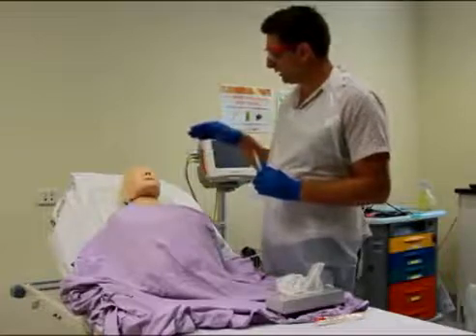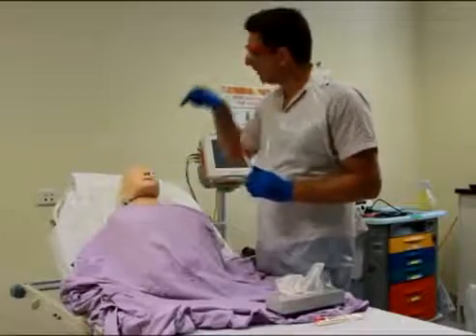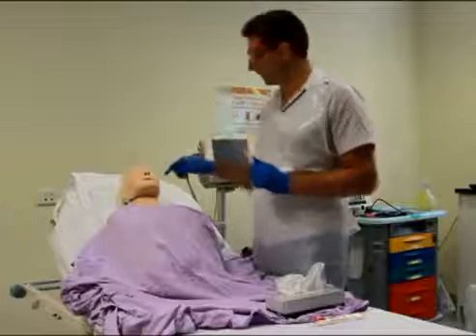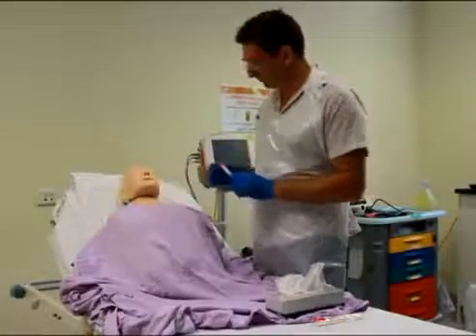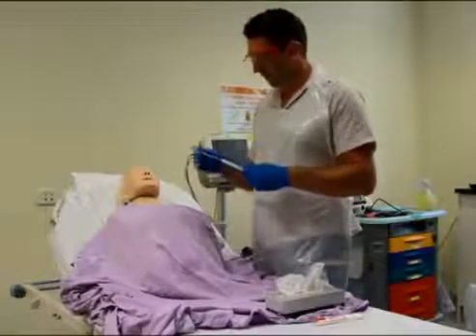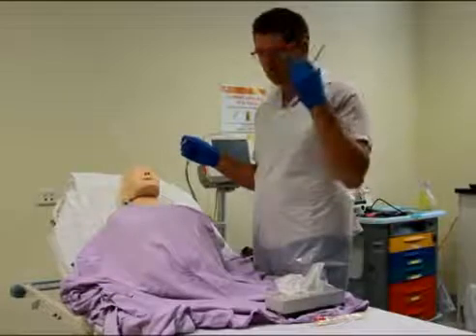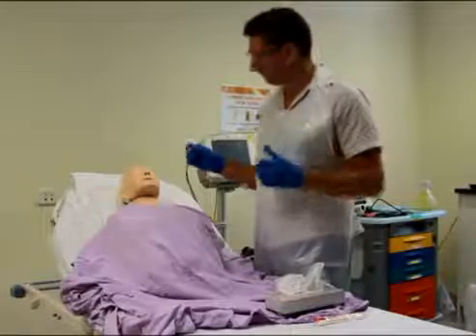When I insert the swab, I don't want to insert up into his eyeball — I want to insert straight back down into his nasopharynx, because I want to get a good collection of specimen at the back. Using a non-touch technique, I take out the swab. Make sure you have your PPE on like I have — goggles, apron, and gloves.